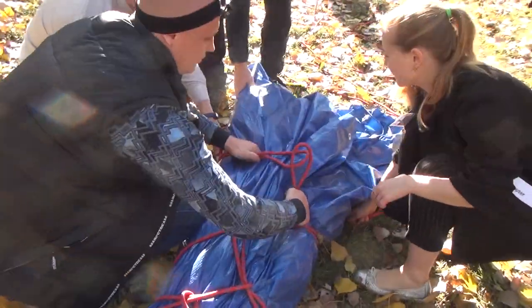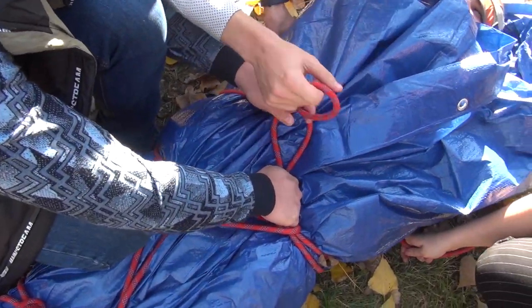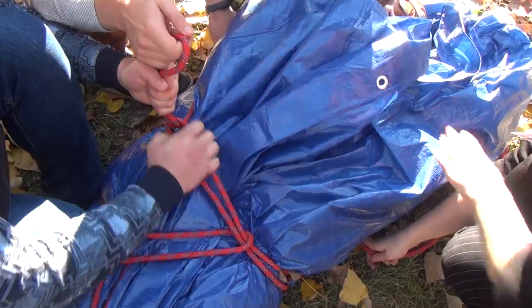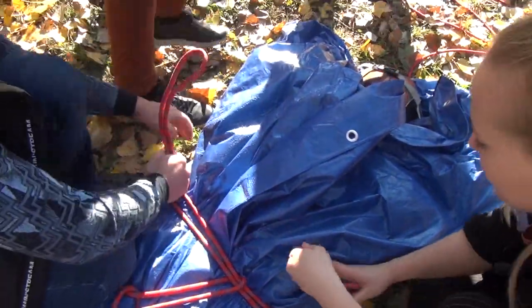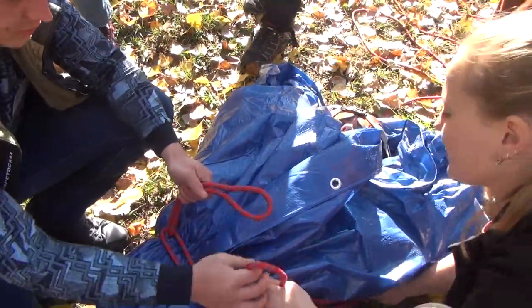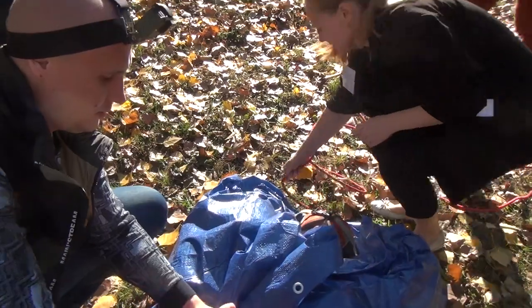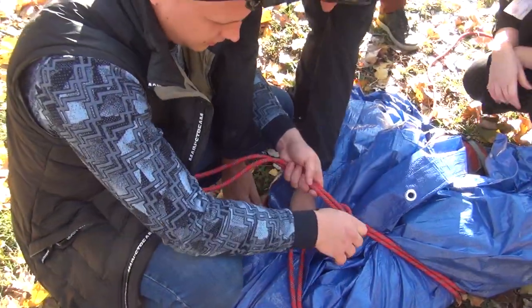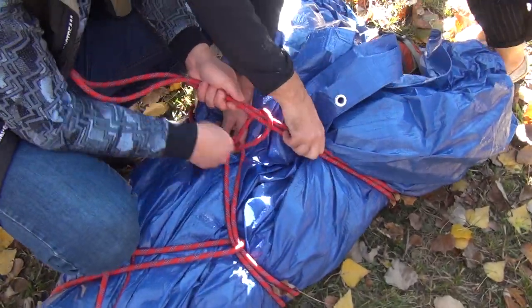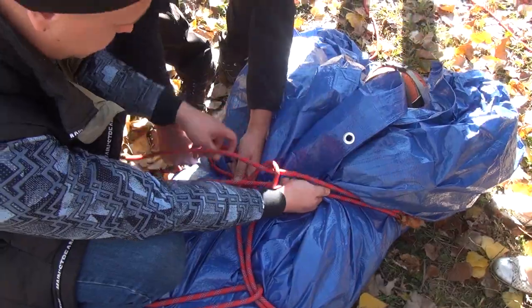And like here, for example, now the pedal, you see the pedal comes up. So to make sure that the pedal stays down. Yeah. So it doesn't go on top of his head or something like this. It's basically like making a mummy. Like here, you have too much, so you have to put these ones right there, and then let's see which one it is. This one going through. Let's see which wire it is.